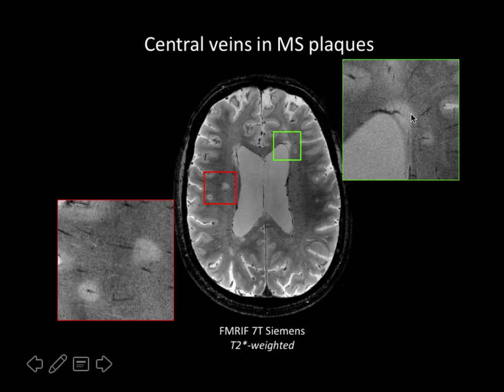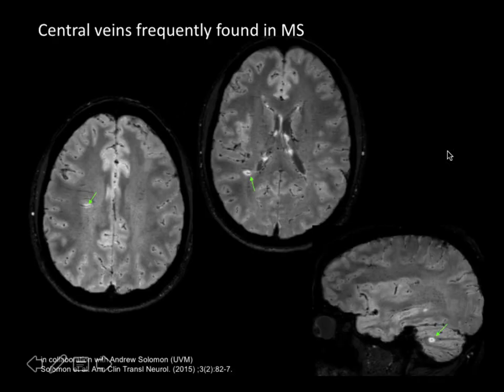And you pretty much see it anywhere in the brain where this lesion is located. So that has actually stimulated the field. This report is not unique. A lot of people using 7 Tesla imaging a few years ago have seen that, and it's been stimulating a lot of research clinicians to actually look at that more routinely and looking at more clinical scanners, like 3 Tesla scanners.